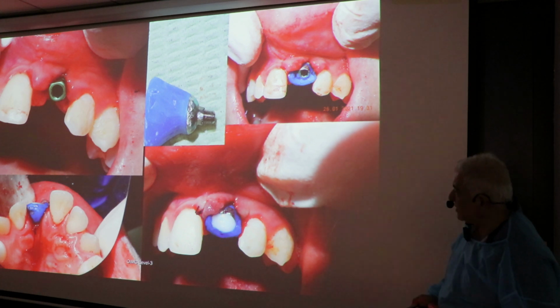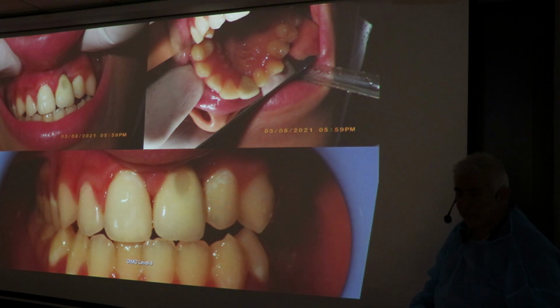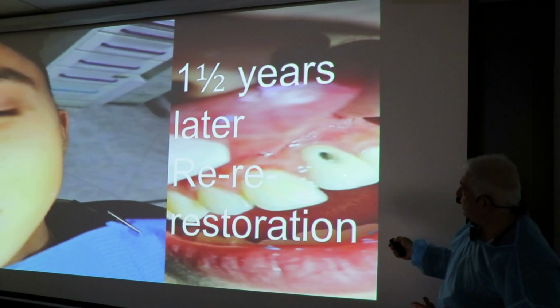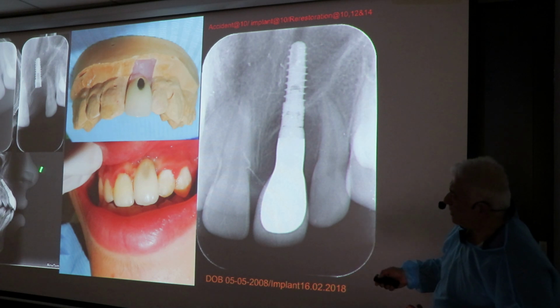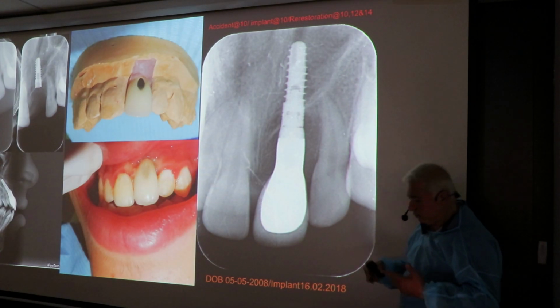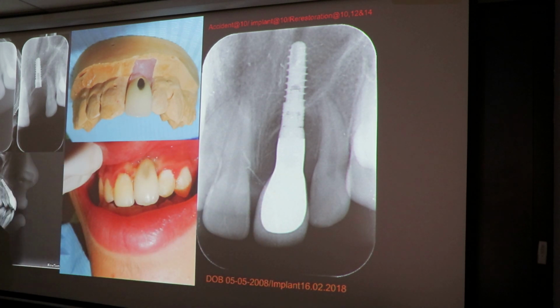So the moral of the story is, as Dr. Sundar said, if the patient hasn't reached the maximum vertical growth, this is the harm you're doing to the patient. Once we did it to the right height, he came after 1.5 years. Again, there was shortness. Again, we did another crown. So pay attention to this vertical growth. It does look very awful, especially if the patient has a high smile line. Unless you remove the implant, bone graft, soft tissue graft, re-implant, nothing else can be done.